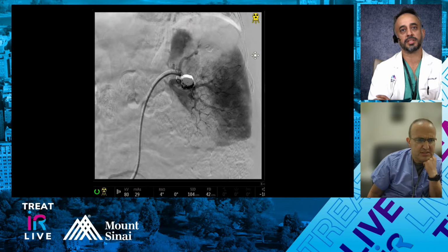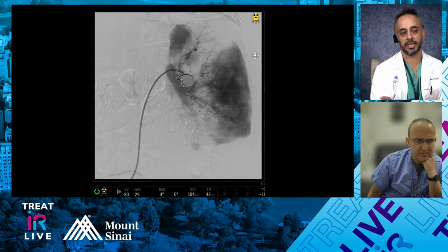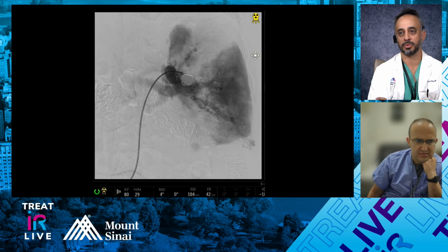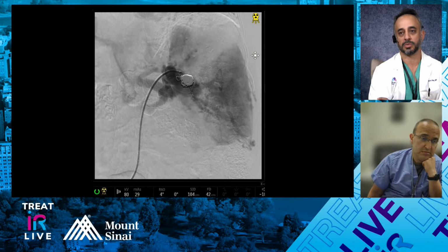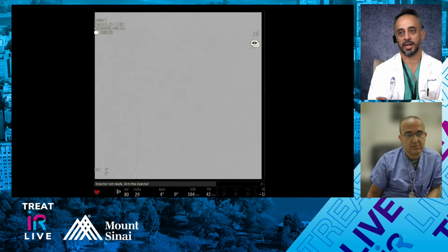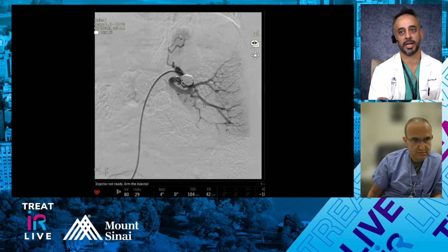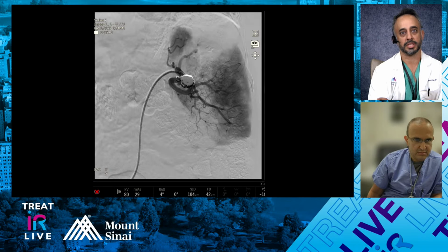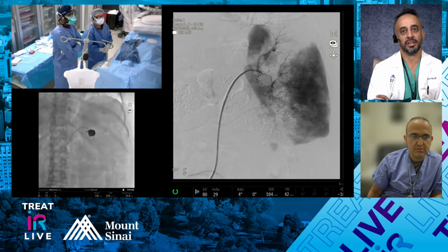When we do renal aneurysms, it depends on how the setup is. We did a case recently where we used a carotid stent as a stent assist, and that one we heparinized just because we had such a big system across. We're not checking ACTs or anything, but just at the beginning when we're putting out the stent, we heparinize a little bit so we don't get clot going distal. But typically, no. I think it's sort of like a one-off.